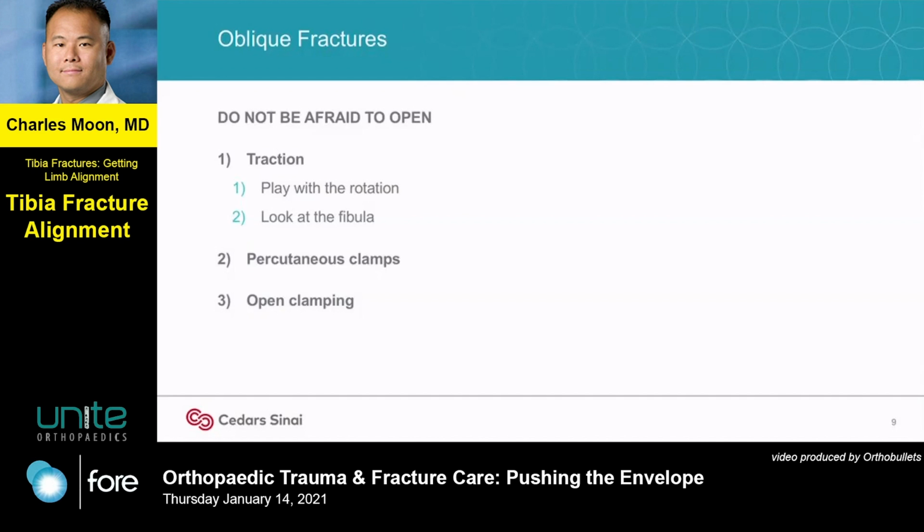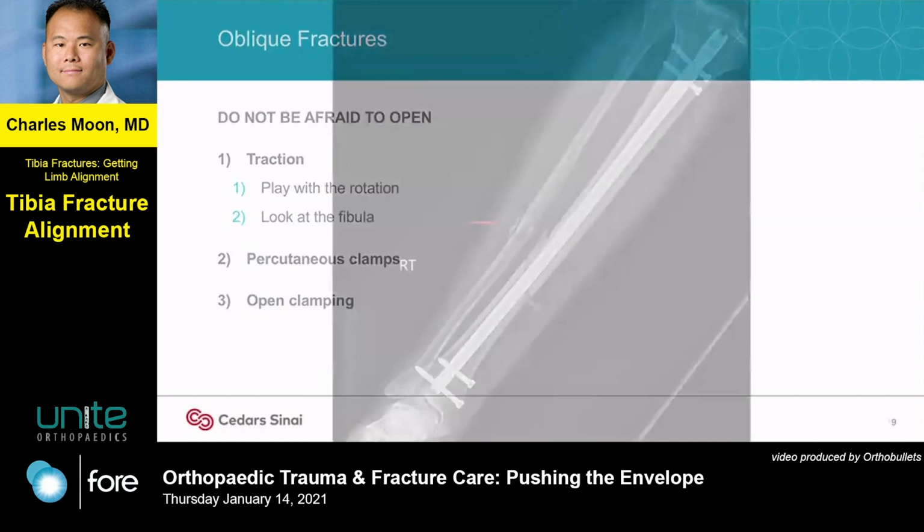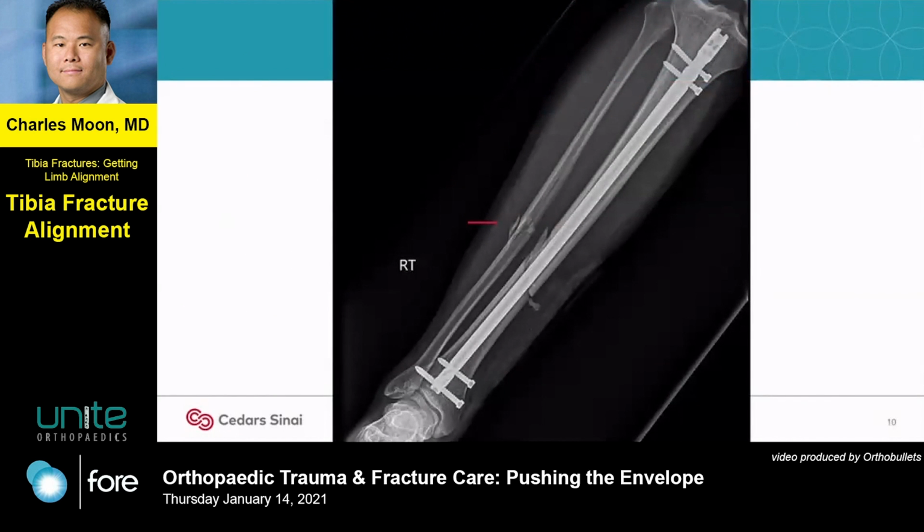And if you do the traction and you're operating by yourself, use a 2-pin X-fix, femoral distractor, something like that to help yourself out. Again, look at the fibula. I'm going to harp on that because I really believe in that. And then open it up and clamp it. In this case, you can see the fibula looks good.